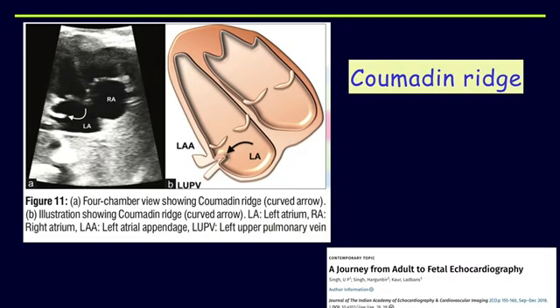Here you can see an echogenic area in the left atrium. Identification of this will indirectly indicate normal drainage of the left upper pulmonary vein, and therefore help exclude total anomalous pulmonary venous connection.